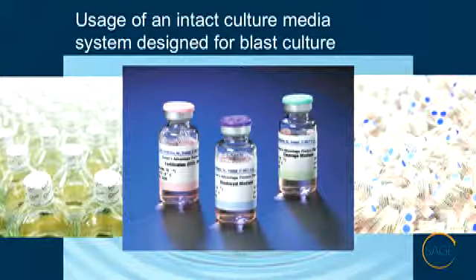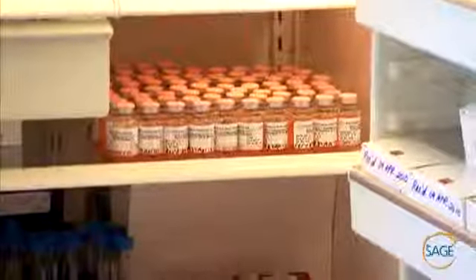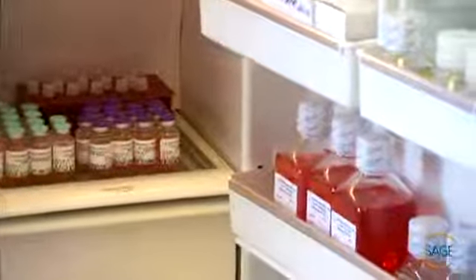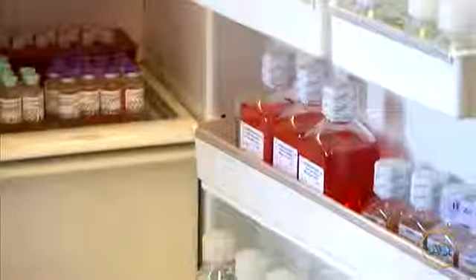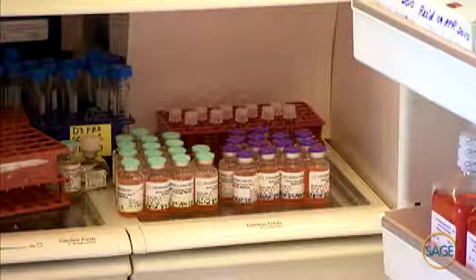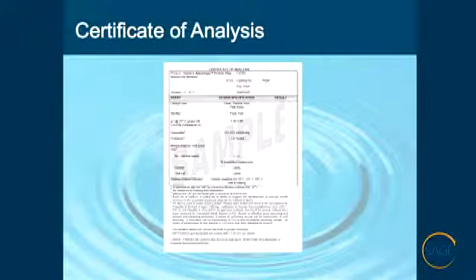The laboratory should utilize all the media and reagents consistent with one vendor, thereby reducing shock to the embryo induced by the introduction of different base components, buffering systems, or pH culture requirements. Care should be taken when storing and handling all media solutions used for culturing embryos in the IVF laboratory. Culture media is not inert and reacts rapidly to the climate and atmosphere of its surroundings. Media should be utilized within the manufacturer's reported expiration date and stored refrigerated until usage.